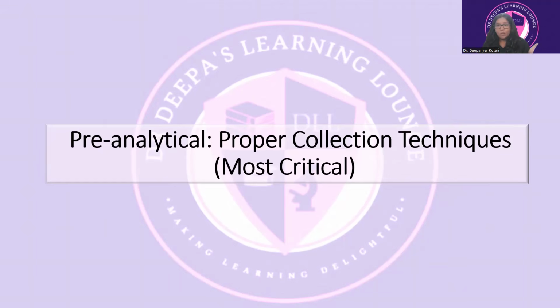If it is the patient problem, fine, you cannot change it. The patient is undergoing hemolysis, you can't help it. There, you have to put a comment saying, read these analytes which can have possible interference because of hemolysis with care. Pick up the phone, talk to the clinician, tell him that this is unavoidable, and these are the test results that you have to look at with caution.